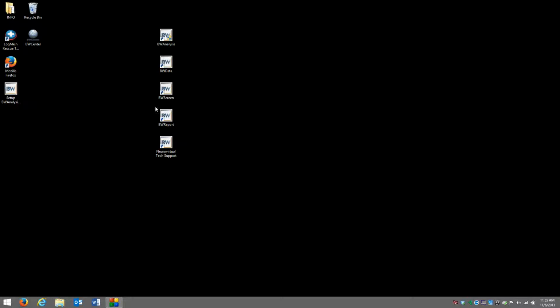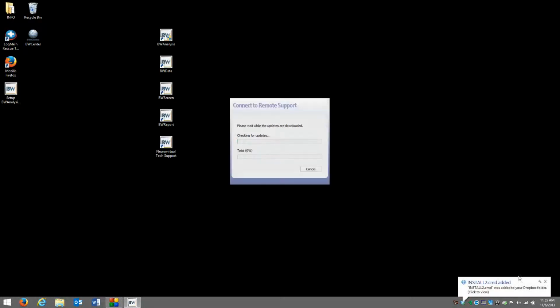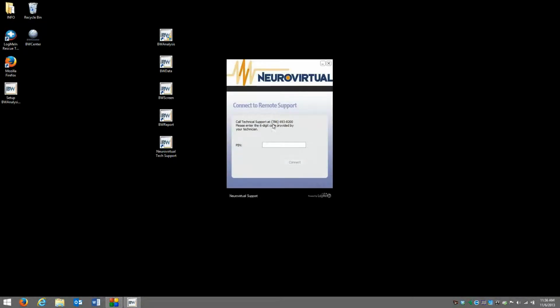Neuro Virtual Tech Support is the tech support app, and once you click on it, it will automatically prompt you with a support number, which you can call 24/7 for technical support and assistance. Our agents will be on standby. They'll give you a 6-digit PIN code, which you type in. Once it's typed in, you click connect, and we're in. We can troubleshoot, update software, and answer any questions related to the hardware or the software.